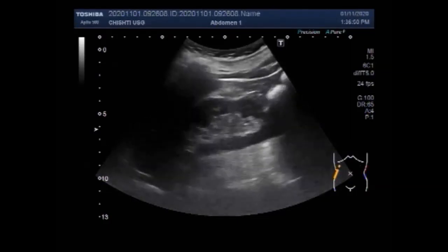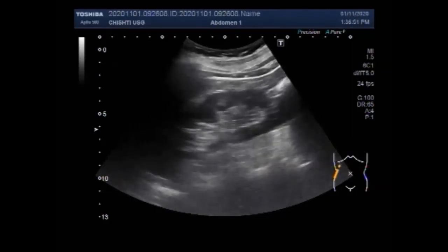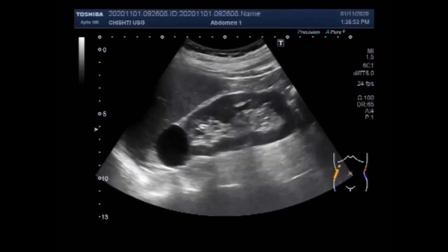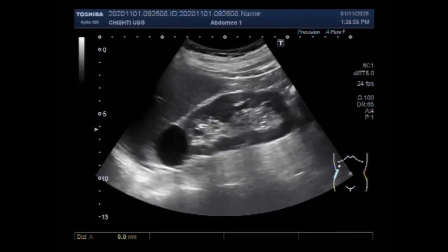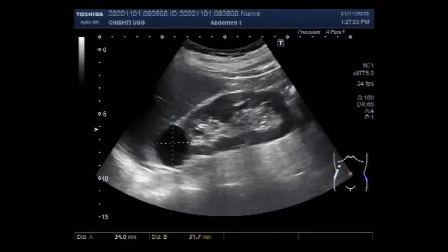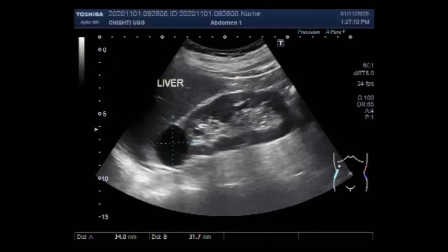Renal cyst — you can see the right kidney and it has a cyst in the upper pole of the kidney. Multiple findings are renal cyst, vesicle stones, benign prostatic hypertrophy, and calcification in the prostate. You can see the measurement of the renal cyst, which measures about 3.4 cm by 3.2 cm in the upper pole of the kidney.